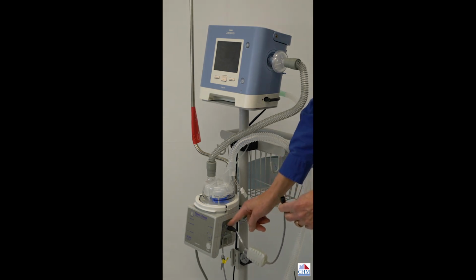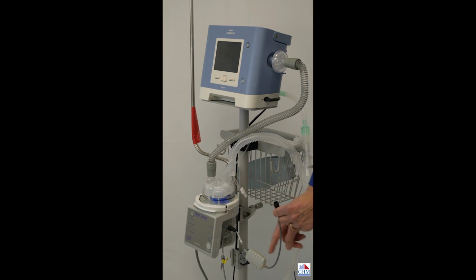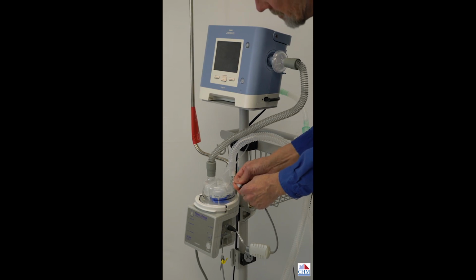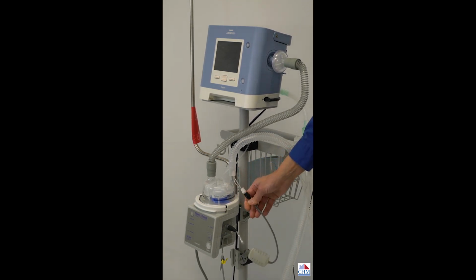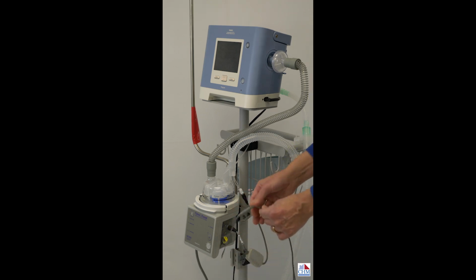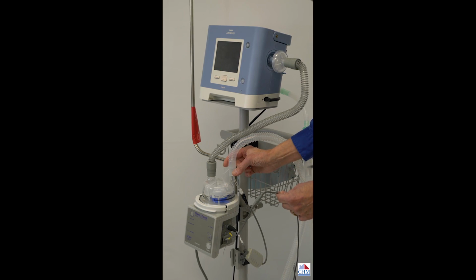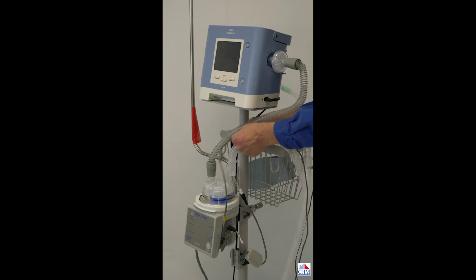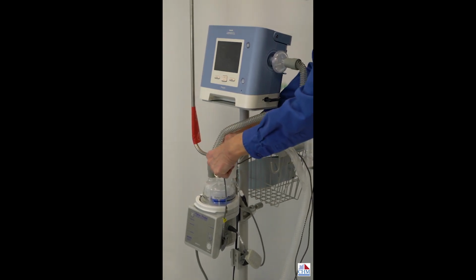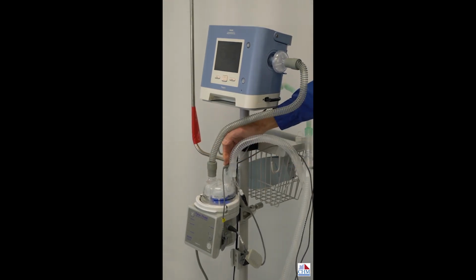This is our electrical connection going to the heated wire that is running through this tube all the way through. And the reason for the heated wire is to maintain the temperature all the way through, so we have less condensation. And then we've got our temperature probe, and our temperature probe attaches to a hole right on the top of the chamber here, and that is able to sense the temperature of the air coming right out of the heater, and that's one spot it's monitored.